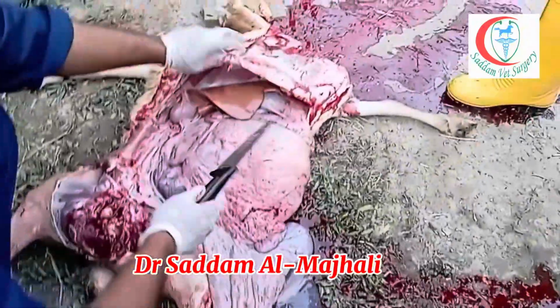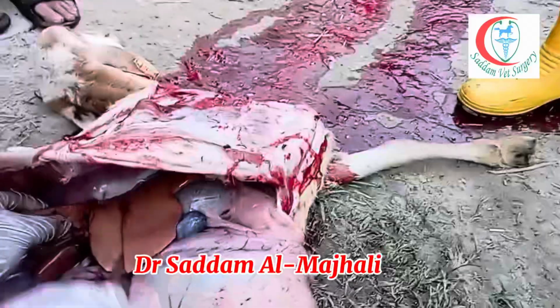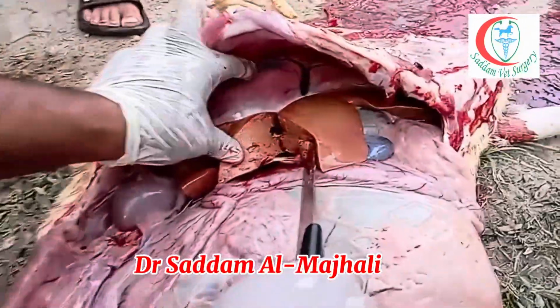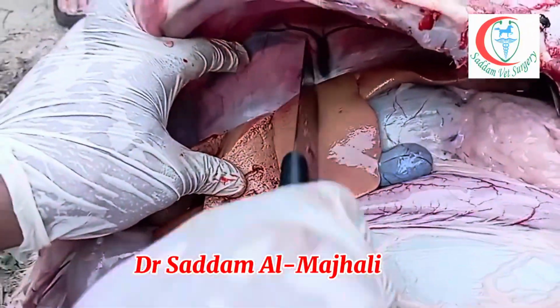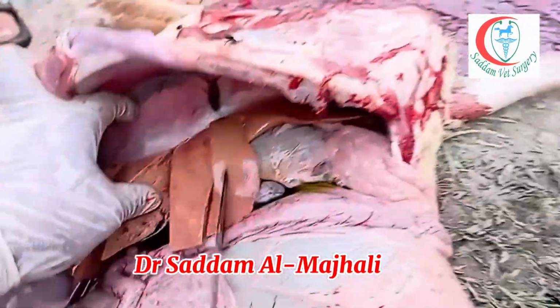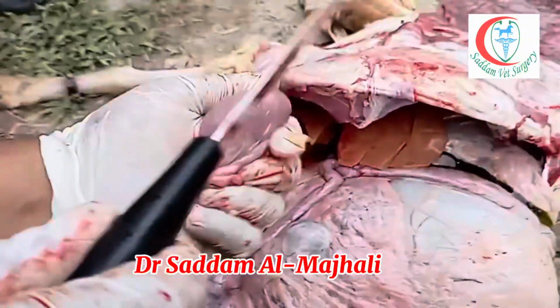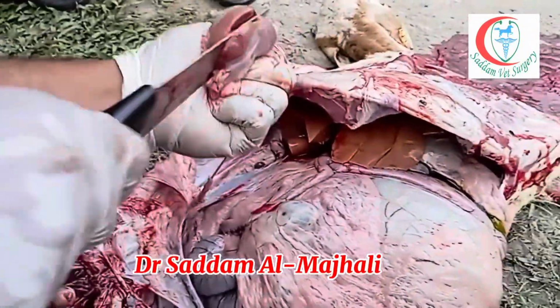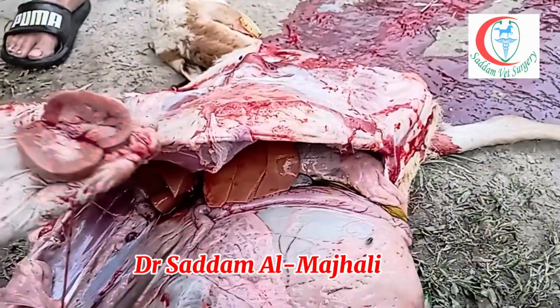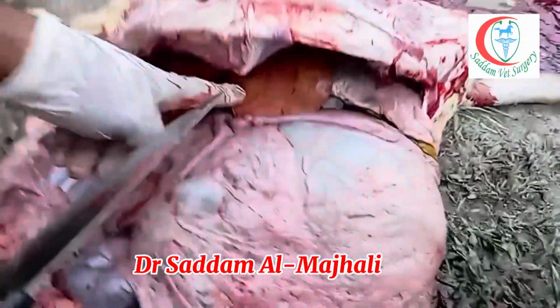You see, what I do for the liver, I cut. See, very crashy and the color is not normal. So that means the liver does not work much. I see the gallbladder. Okay, this is the kidney. To take the kidney, I make a cut like this. I see the nephron inside. The kidneys look normal, no infection in the kidney. But liver problem. Why liver problem?